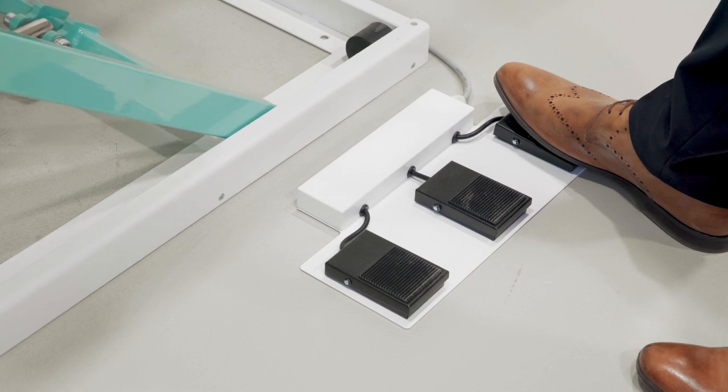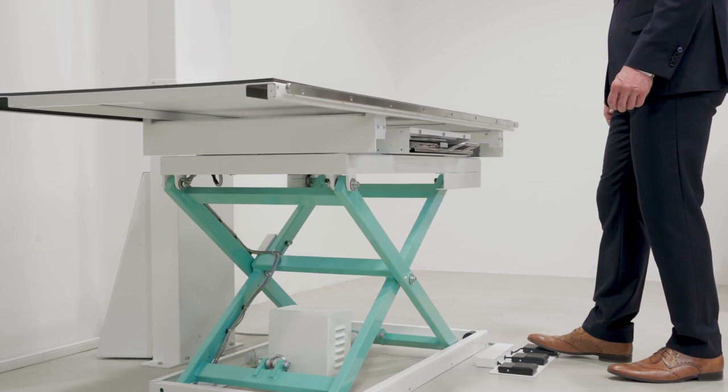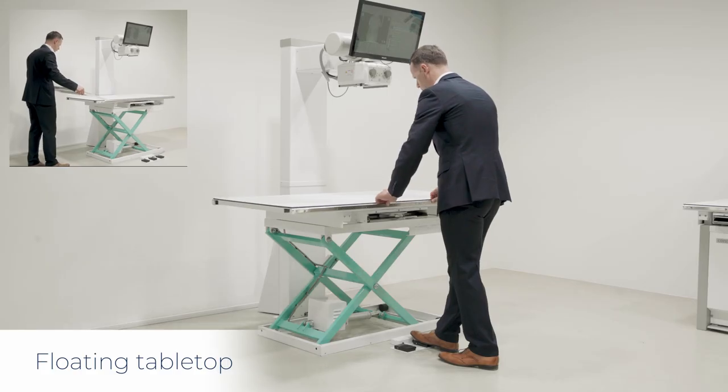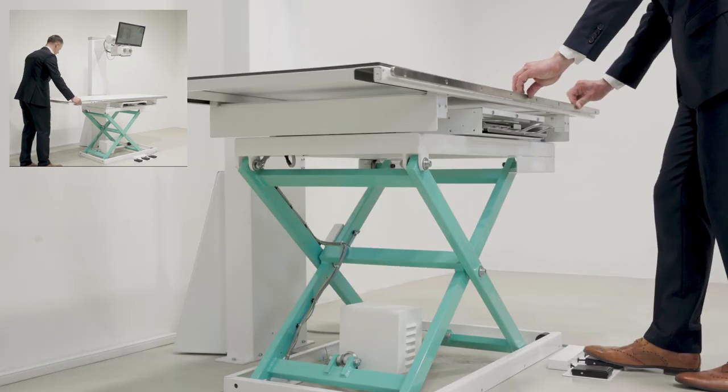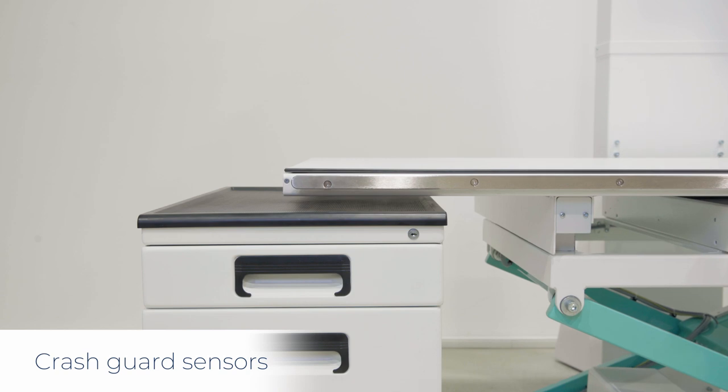The table is fitted with wired foot pedals, but we also have a wireless option. Vetelef is delivered with a floating tabletop which can be further extended, providing substantial freedom of positioning.